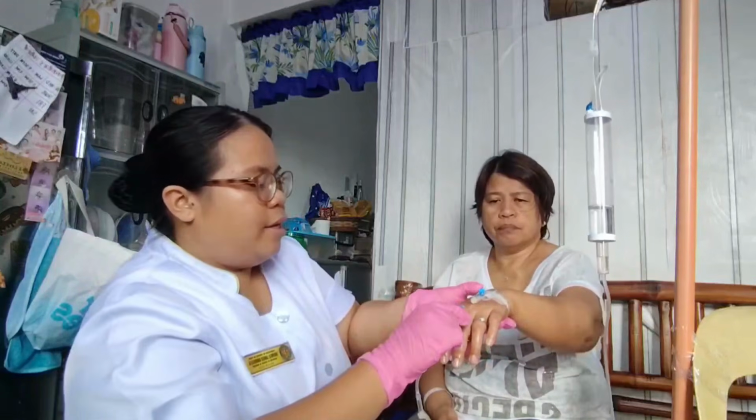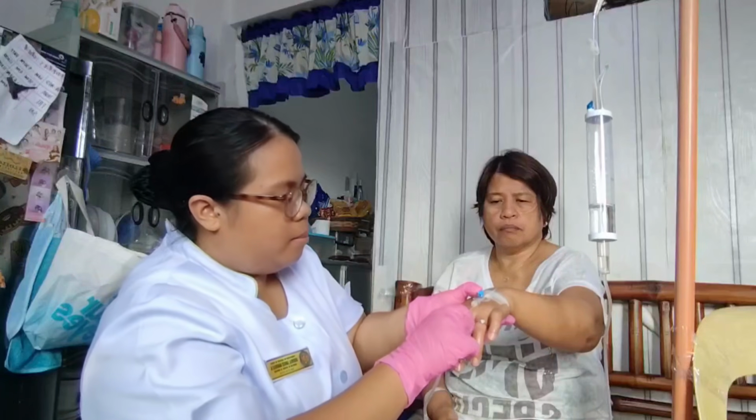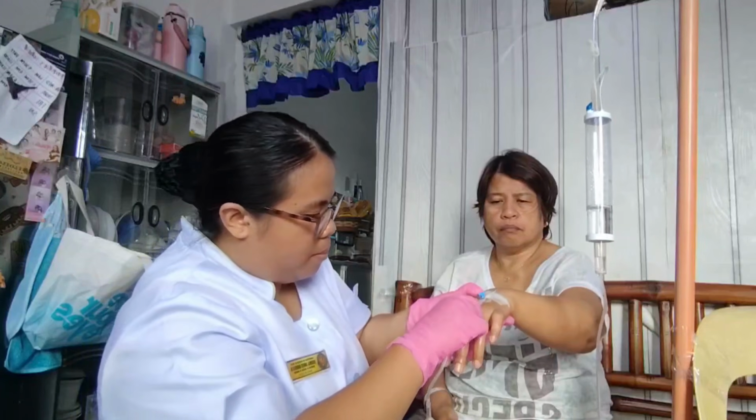So since this needs a needle, we will put a needle and then we will put this into the HEP lock. Okay, then after that we will secure this with micropore tape.